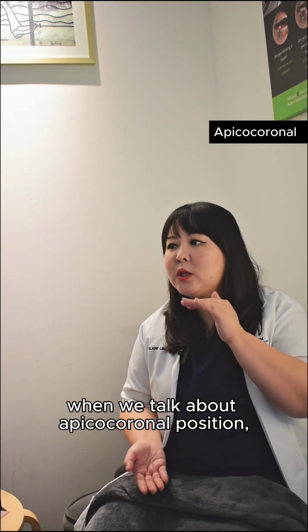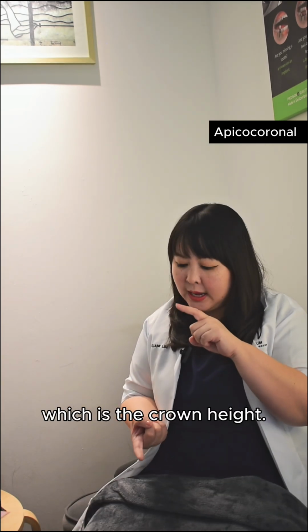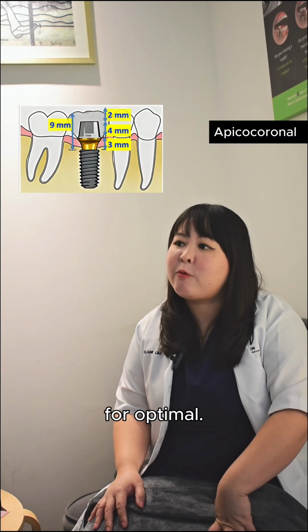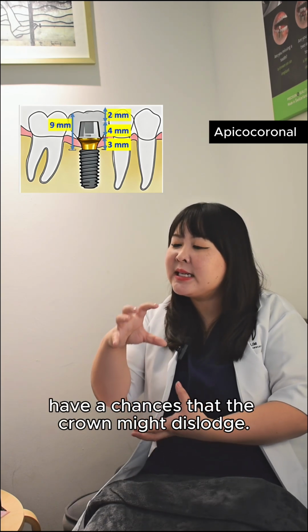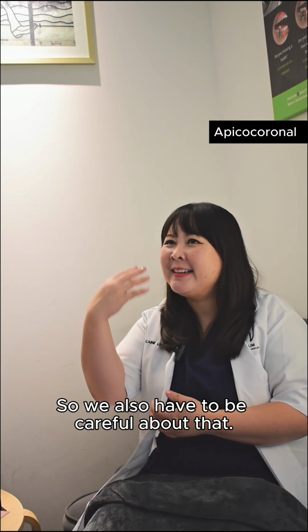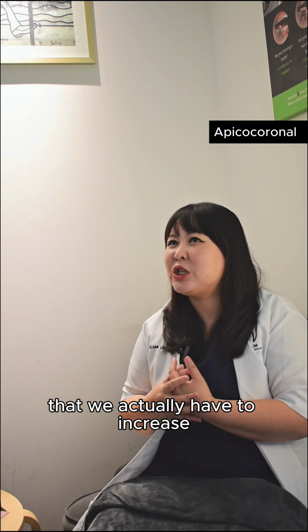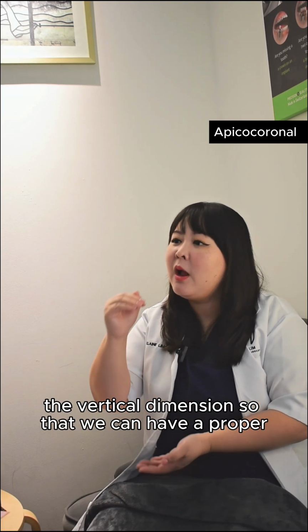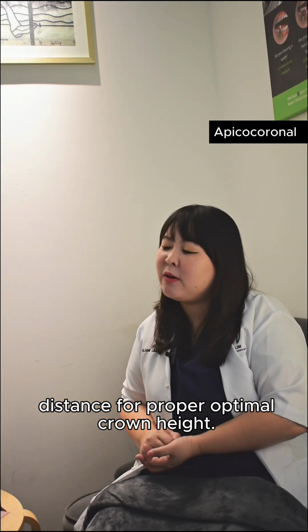Secondly, when we talk about apical-coronal position, which is crown height, ideally we should have about 9 mm if possible for optimum. If we have anything shorter than that, there is a chance that your crown might dislodge. So we also have to be careful about that. That's why I showed you the cases just now, that we actually have to increase the vertical dimension so that we can have a proper apical-coronal distance for optimum crown height.